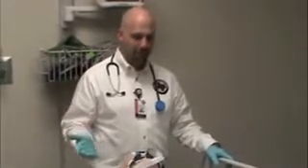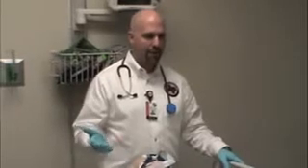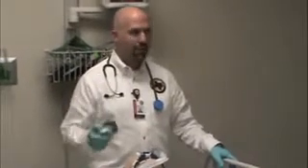I'm going to teach you guys an acronym called DOPE. And DOPE is a quick, down and dirty way to troubleshoot a ventilator problem. So the first thing that D stands for is dislodged. If you have a ventilator alarm and you're worried that the tube might have gotten pulled, you might want to take your laryngoscope back out and take a look and make sure your tube's in the right spot.